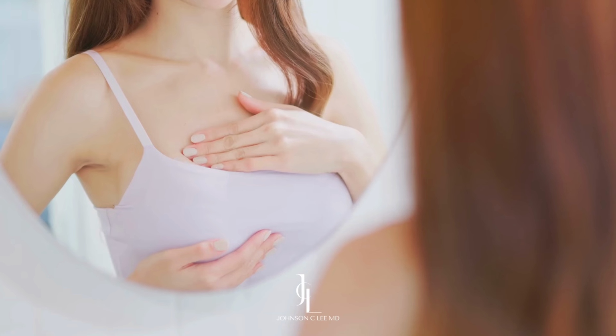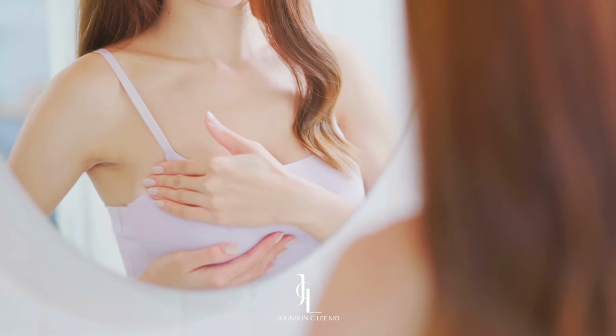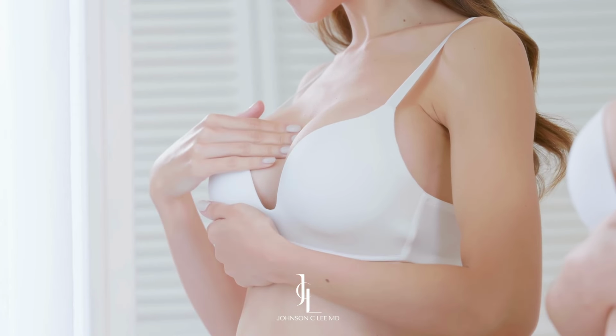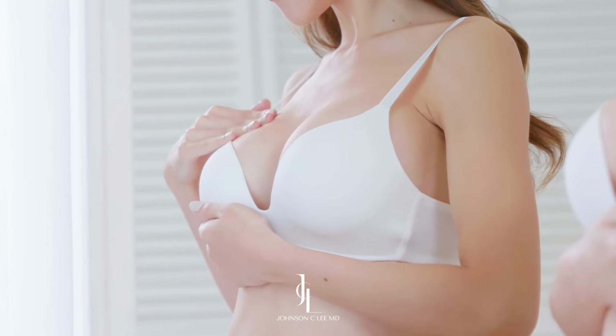So in the office, I have a sizing kit. I use this on patients so that they can wear actual molds of breast implants into their bra and they can wear their favorite shirts and outfits to see how they're gonna look. But for some patients, it's very hard to tell exactly what size they're gonna get because maybe they have baseline asymmetry or very different size breasts.